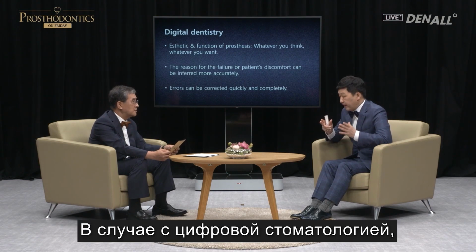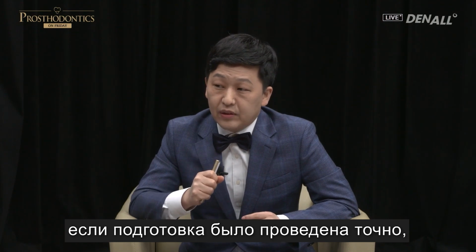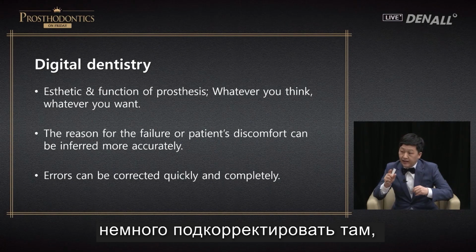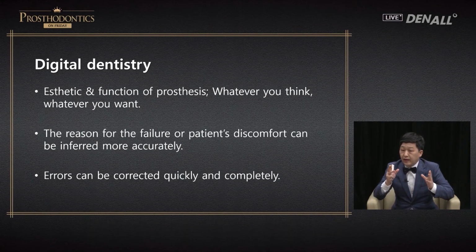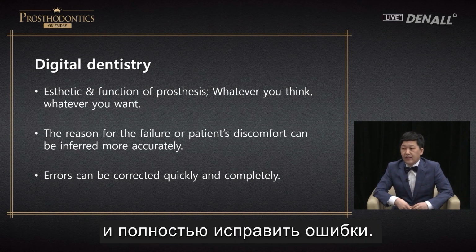In the case of digital dentistry, if prep has been done accurately, you can just slightly adjust where the patient feels discomfort with a couple of clicks, and you can quickly and completely correct the errors.